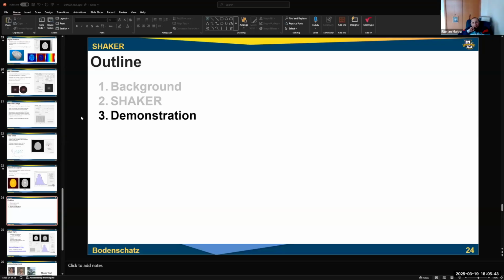So how do these simulations compare with NeuroSim? They look comparable. It's a little bit different because NeuroSim simulates in image space and they do magnitude images. That's right. Whereas we're simulating in k-space and doing complex, or magnitude and phase. So you're getting a little bit more here in that regard.